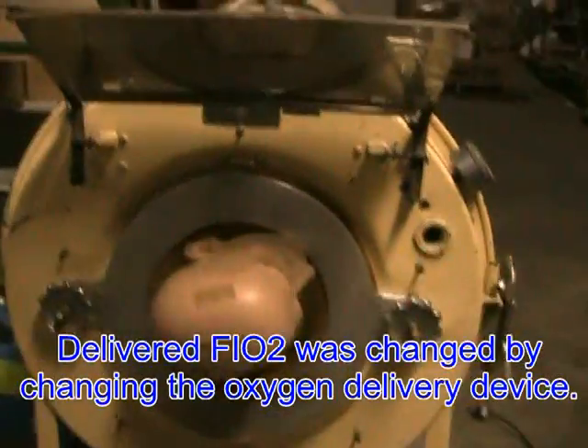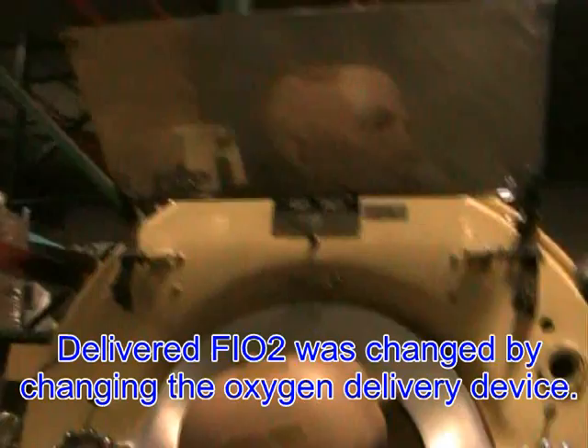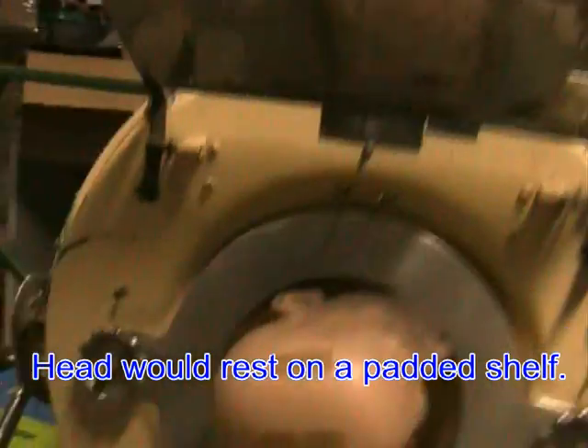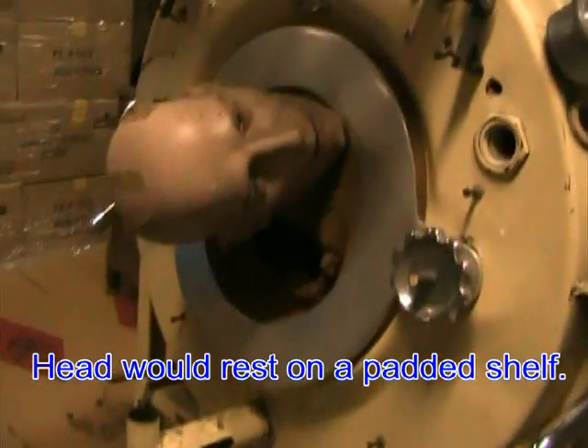The patient could see staff and others through the mirror, which is reflective and only metal, not glass. The head would be resting on a little plate — a little table — which is missing in this one.